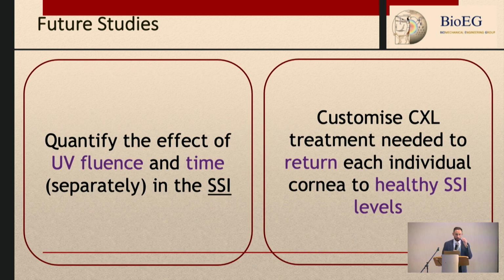Future studies will help us to quantify the effect of UV fluence and time, and help us to customize cross-linking and decide whether we need to treat a patient differently in areas of the cone.